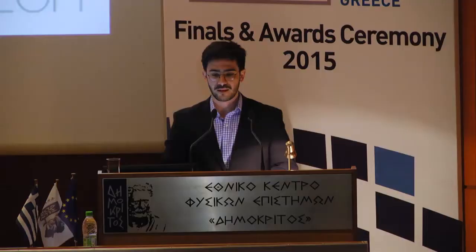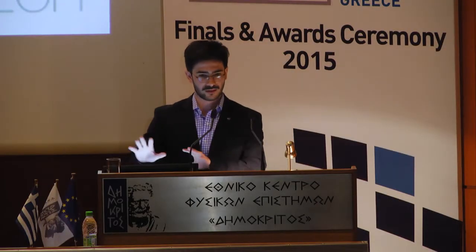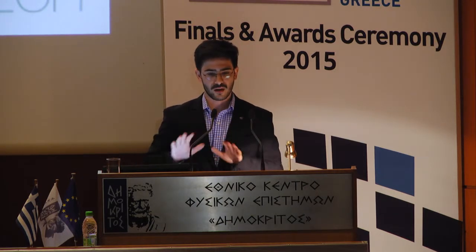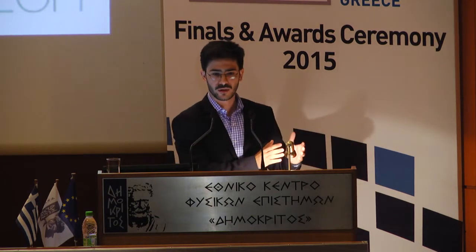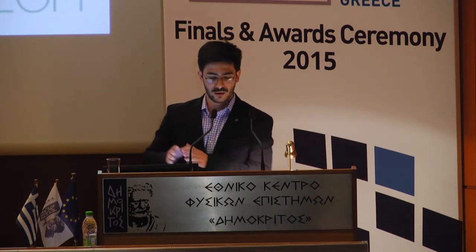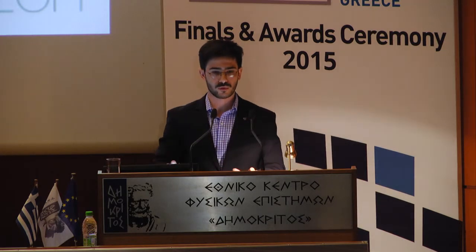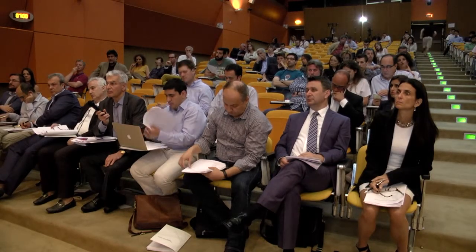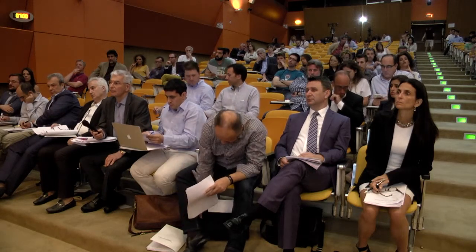No. The MRI scanner and the workstation at the moment are totally separated. The current status is that you apply an MRI scan, the information is stored on the hospital servers, then you have a static workstation with pre-installed software, and you just open the exam, open the information, and do the processing with the existing software.